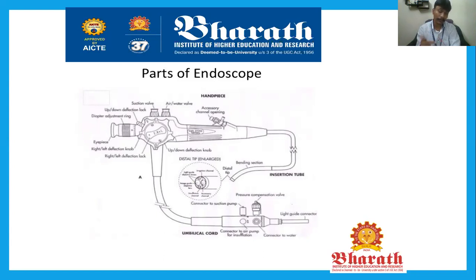the inhale and exhale process of the human. There will be a probe-like structure carrying a light guide connector, where light will be mounted inside the tip. The camera will be placed there. That camera will be capturing the internal structure of the human body. Once the image is captured, it will be stored as an image. The data will be collected and stored as an image through the fiber optics application.